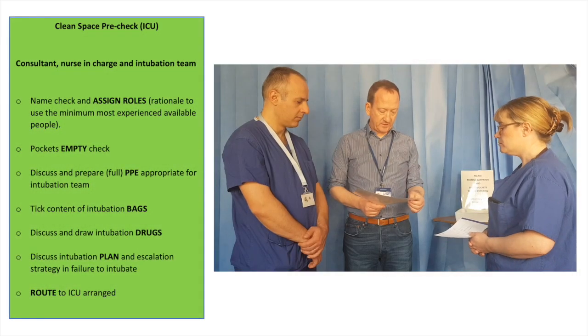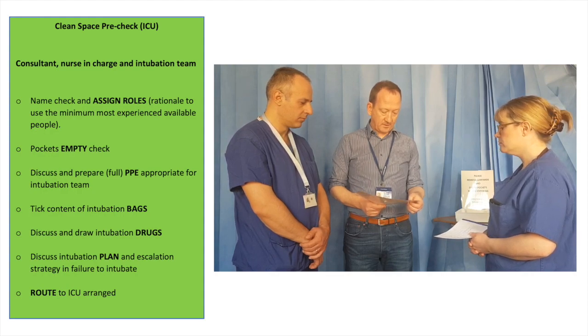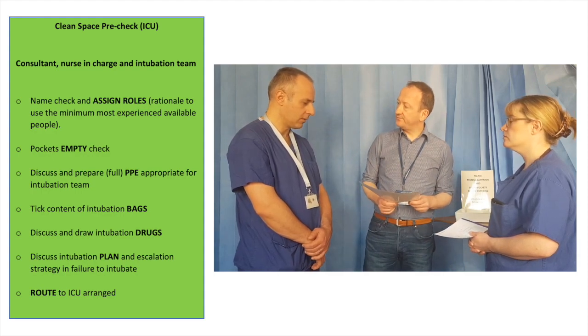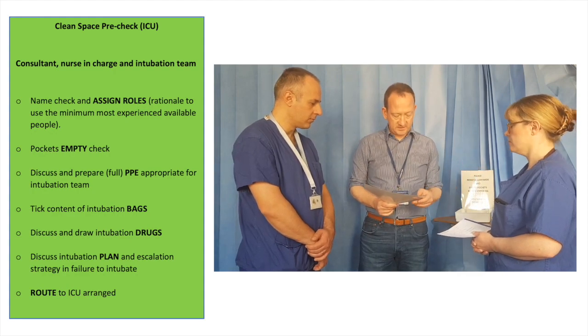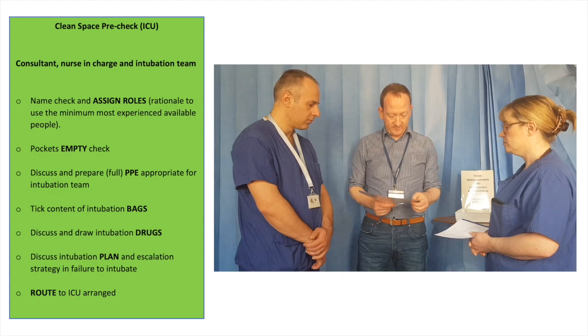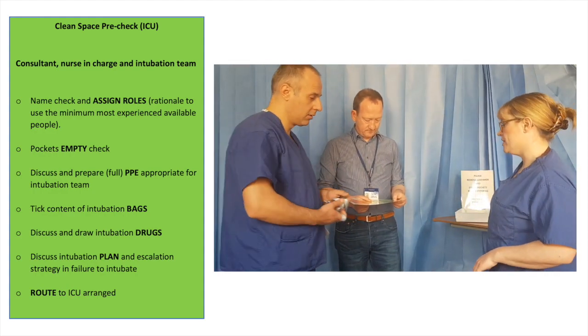Okay, so we can go through our checklist. So we're going to assign roles. Sam, are you going to be our... Yeah, I'm happy to intubate. Let's intubate at the moment, and Sue will assist, and we'll send a third member of the team down as well as backup. Have you emptied your pockets? Yeah, I'll take my stuff. I've just got my big hat which I will wear.